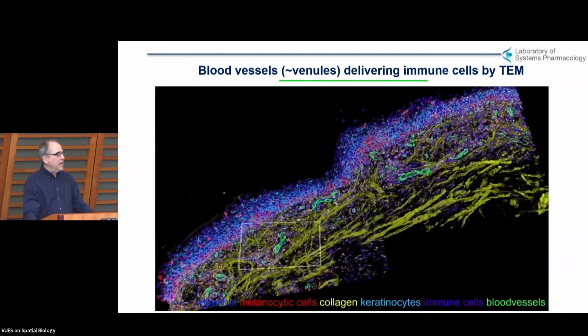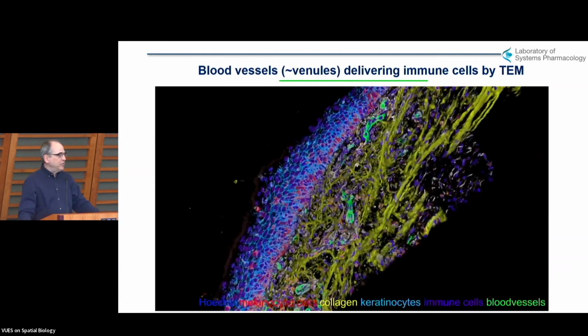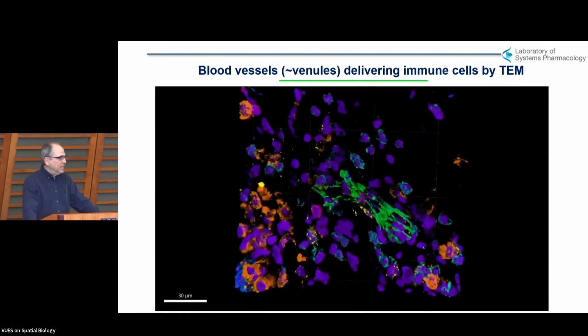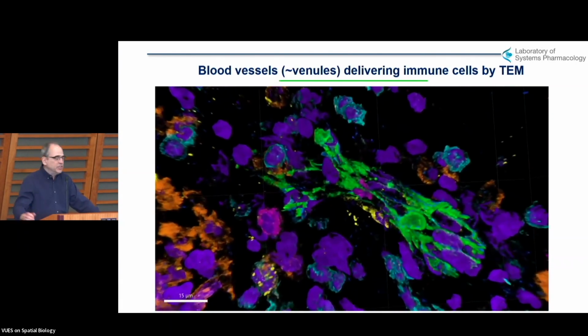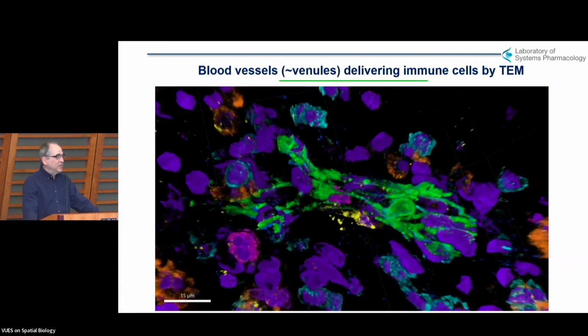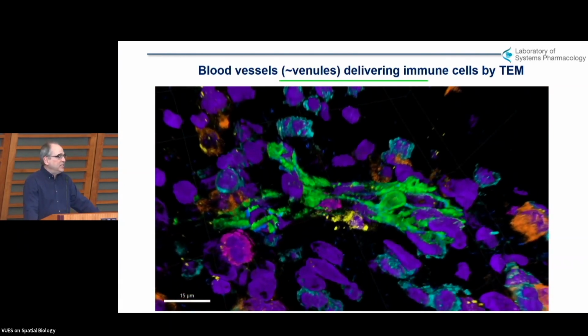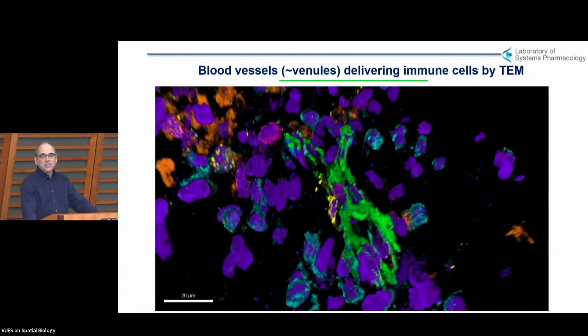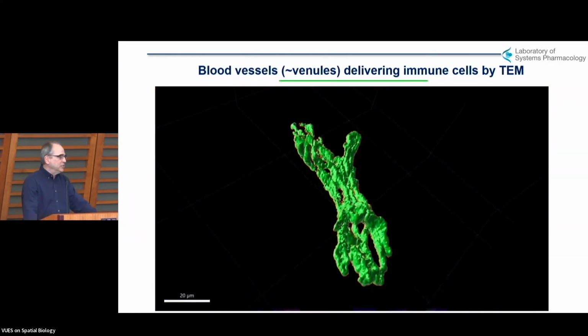So let me just give you an example of one of these. You can also begin to do some 3-dimensional reconstruction. This is an early stage melanoma. This is data that I think Nils's lab has had access to. We've been trying for a long time to publish. This is a 3-dimensional reconstruction of a section of a human melanoma in 56 channels at 200 nanometers resolution.